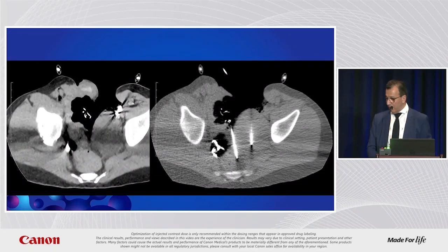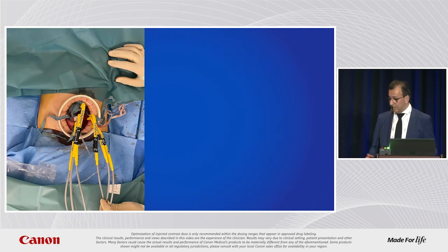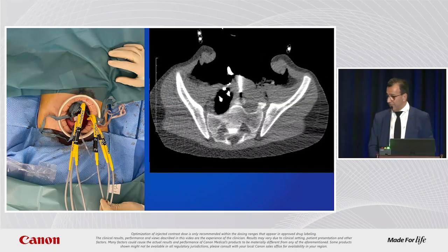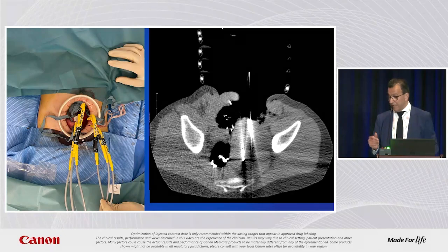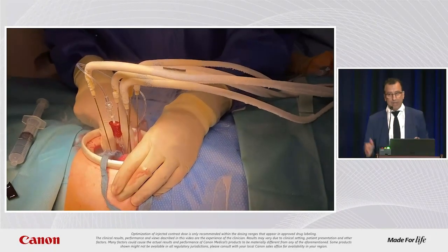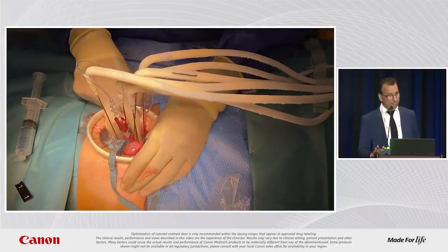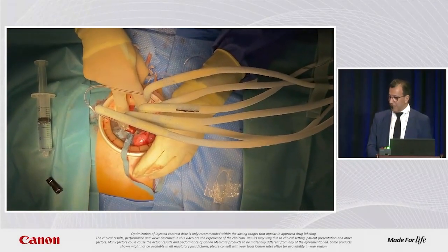So all cryoprobes are in position, hydrodissection is done, as you can see, and then you begin to freeze. Here you are, everything controlled. The CT scan is very important in this phase because you can be fast. 0.3 second CT, a volume. And then here we are, freezing time. As I said, at this moment, you are alone. Eventually, one of the nurses is kind enough to stay with you. That's all you do. And then you wait.